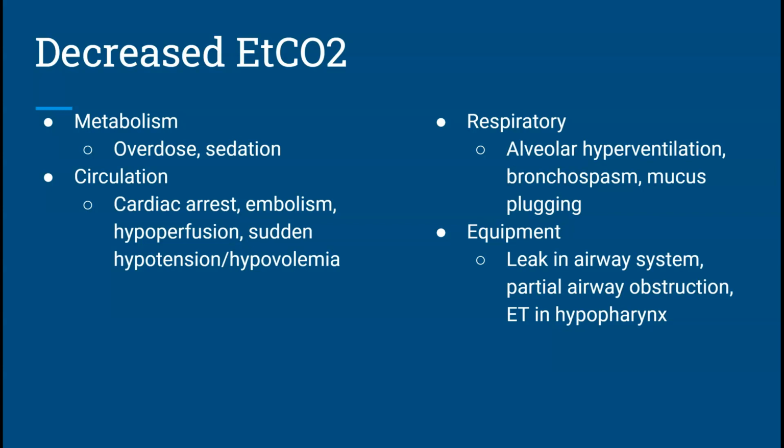You can also have really low end tidal in severe sedation states and/or hypovolemia, hypothermia, right? If your body's metabolism slows down super slow when you're really cold, that's why we can bring back small children from the dead after we thaw them out. That's because their body's not using a lot of oxygen, which means it's not producing a lot of carbon dioxide. So those patients would also potentially have a very low end tidal.